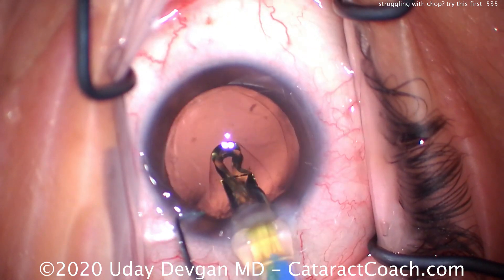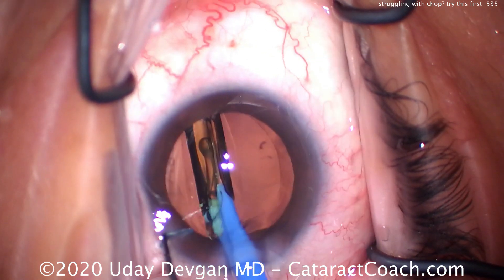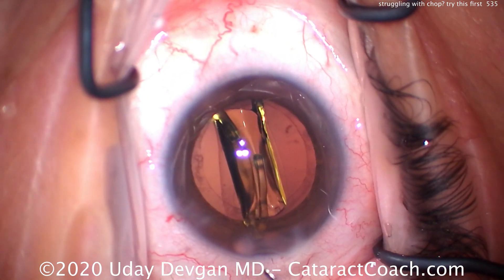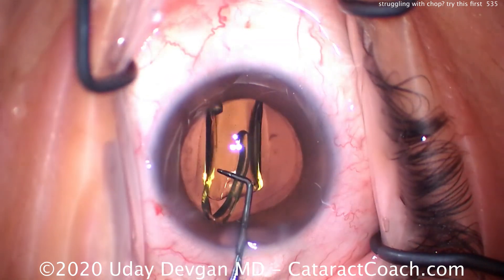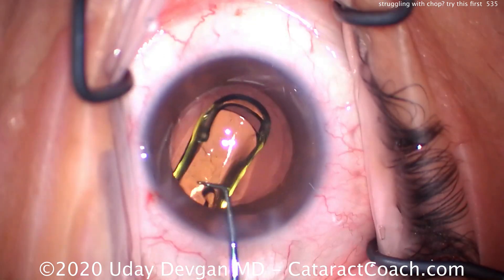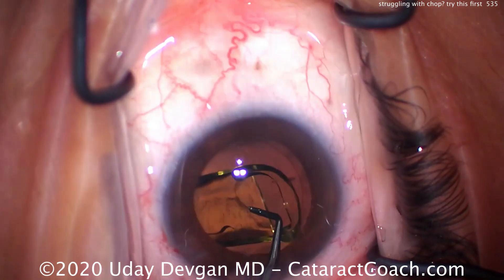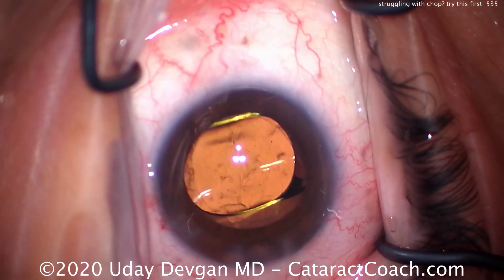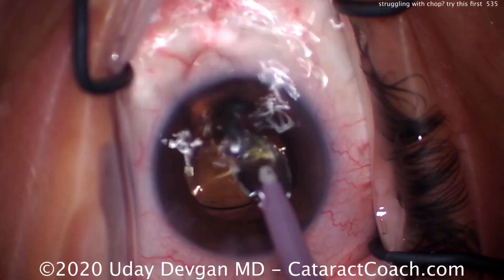There's the capsular bag fully inflated. Here comes the IOL. Let me show you the rest of the case for completeness. The lens is going to unfold in the capsular bag — using the chopper here to dial it into position. This looks great. You can also be very efficient with this FACO flip technique, this flip and chop — it's very efficient.